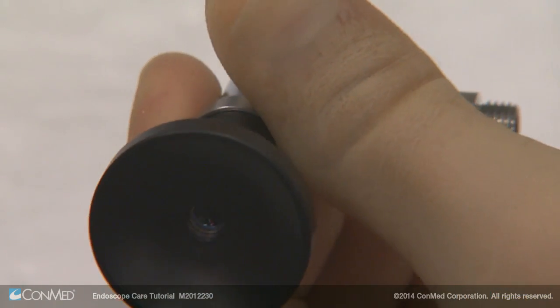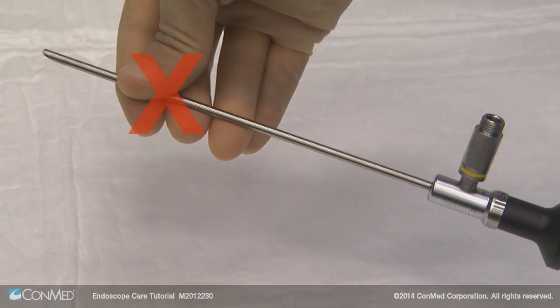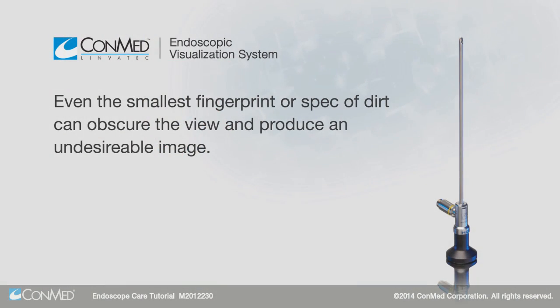The proper way to handle the endoscope is by grasping the eyepiece. Handling by the shaft or contacting the objective lens can cause extensive damage to the endoscope. Even the smallest fingerprint or speck of dirt can obscure the view and produce an undesirable image.